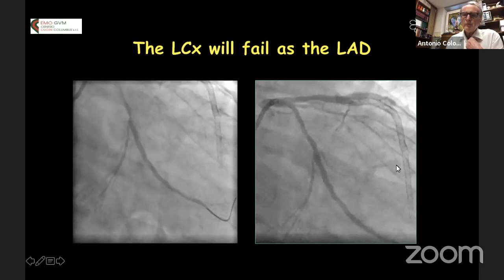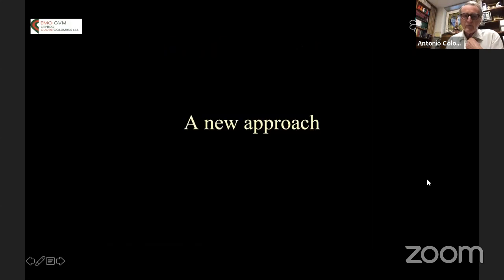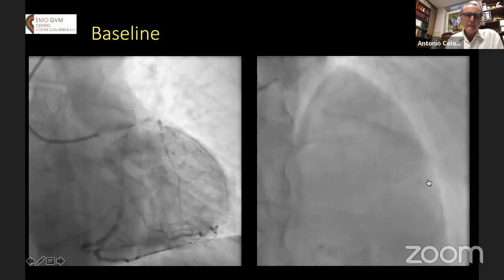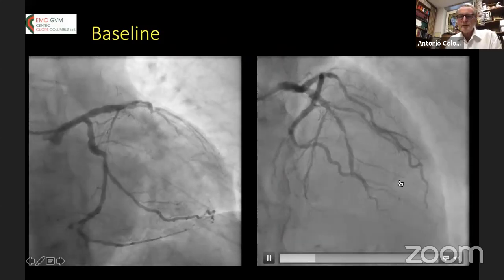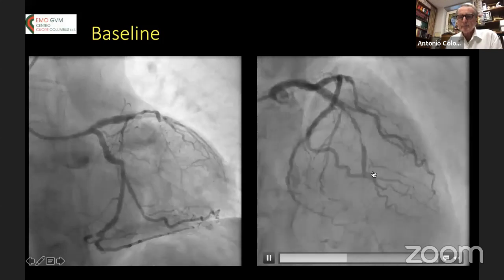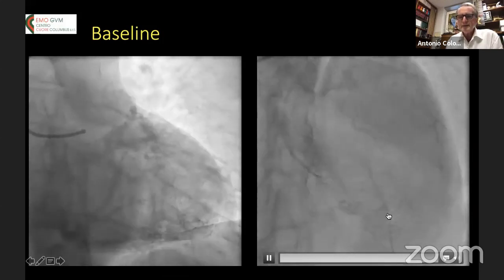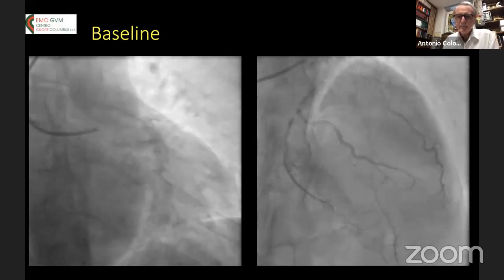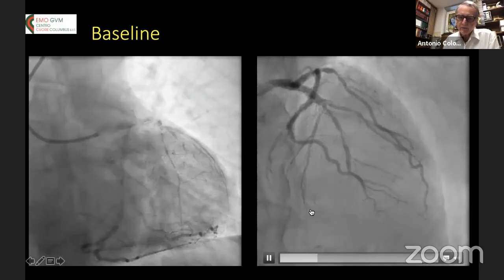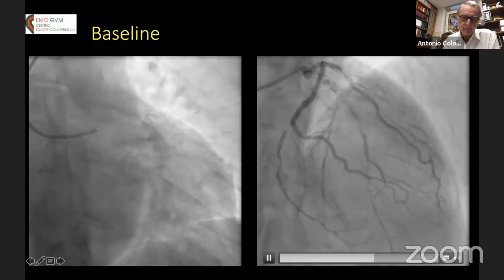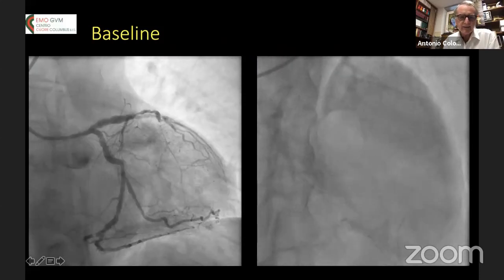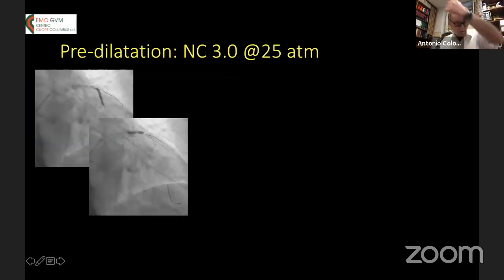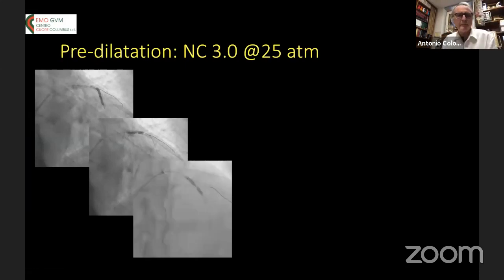We want to avoid this way of operating — that is called the new approach. I start with some examples because I believe it's clear. This is a diffusely diseased LAD. In order to get a good result on this LAD, you would have to implant long and several stents, and you'd get an excellent immediate result. But we took a different approach. I'll go quickly about lesion preparation — this is standard pre-dilatation with some indentation.